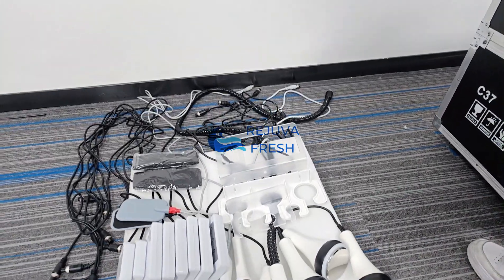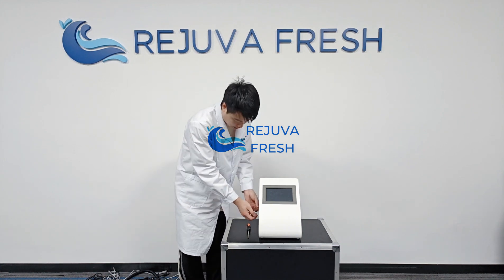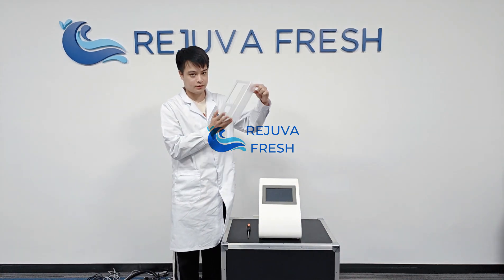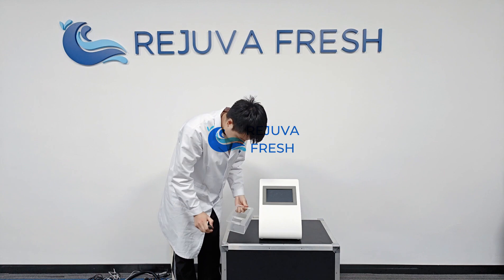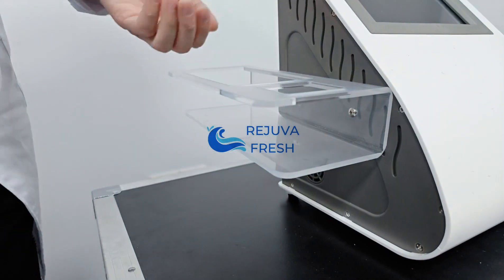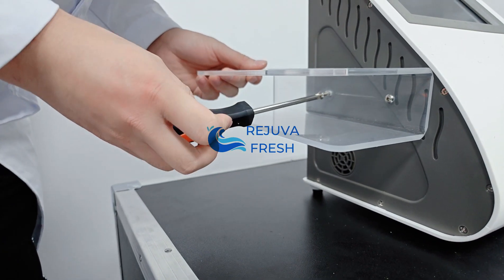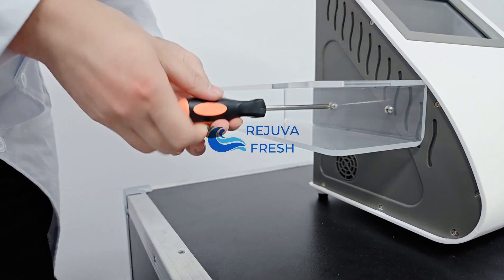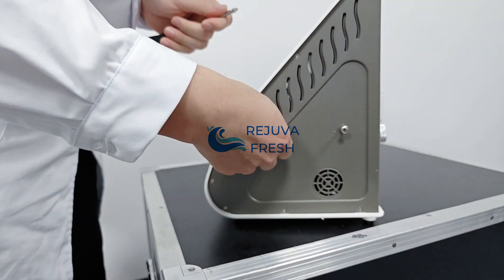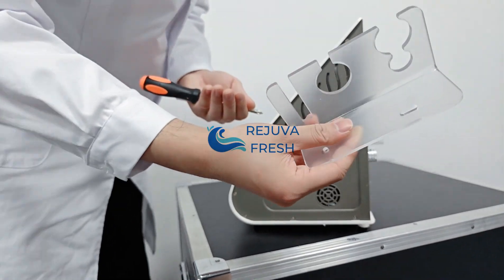Now we're going to install the holding part with the main machine. First, we need to loosen the screws and then connect the holding part for the laser pad — just the big holding part on the left side. On the right side it's the same: loosen the screw first and then connect the small part.